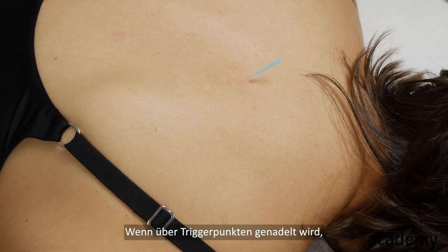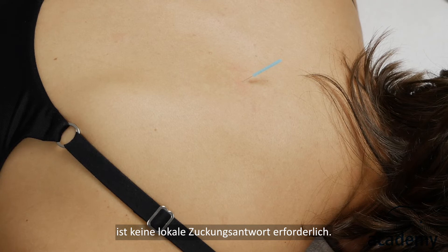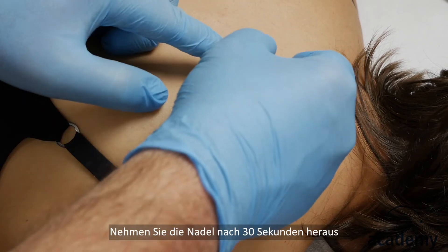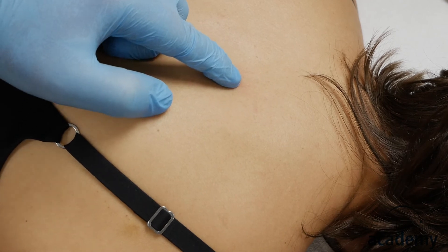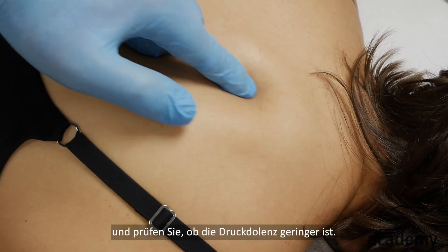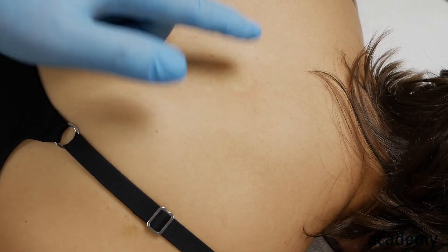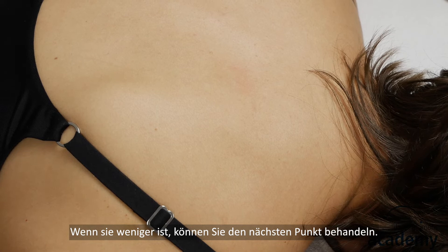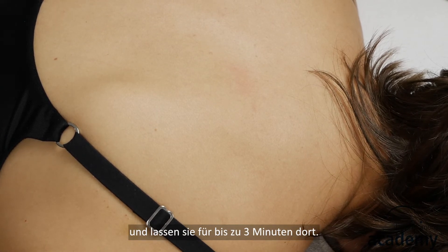If needling over trigger points, a local twitch response is not required. After 30 seconds, take the needle out and check if the tenderness by manual pressure is less. If it is less, then you can treat the next spot. If not, you insert the needle again for up to 3 minutes.